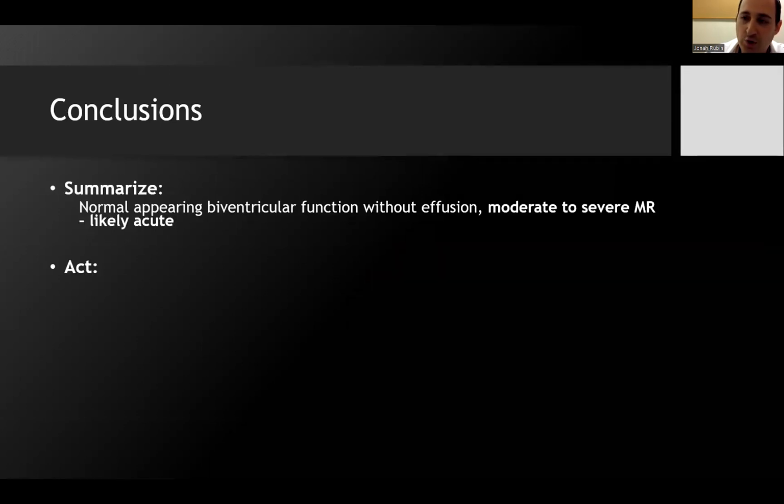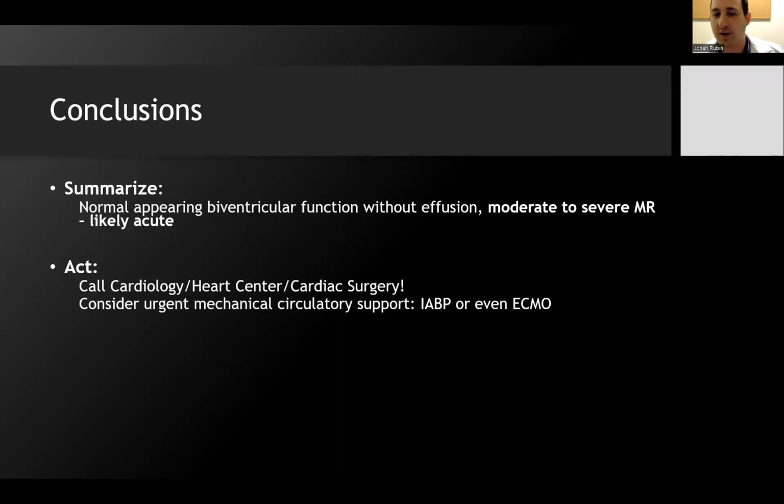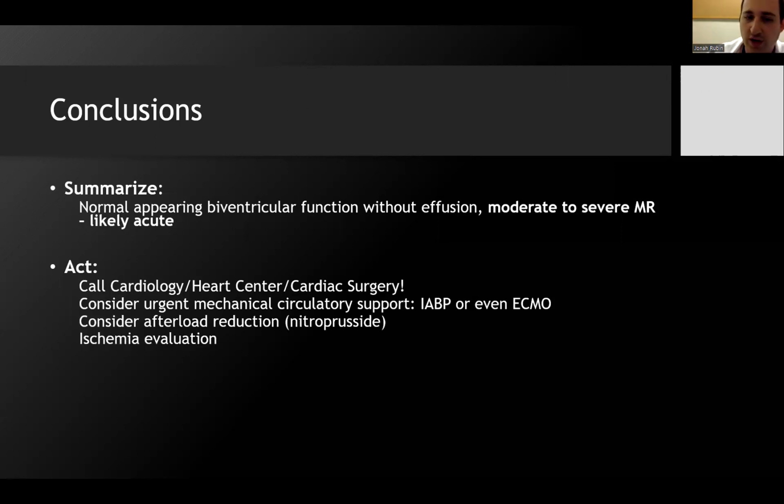And if this patient has new moderate to severe MR, you're calling the heart center, you're calling cardiac surgery, you're thinking about urgent mechanical circulatory support. Acutely, you might be thinking about afterload reduction. You're potentially going to get an ischemia evaluation, right? Your day has completely changed the moment you put color on this patient.